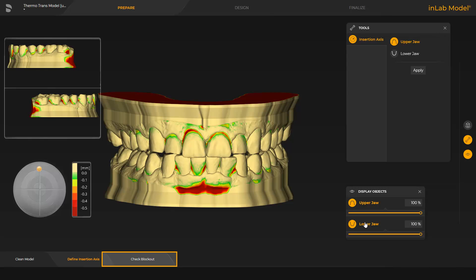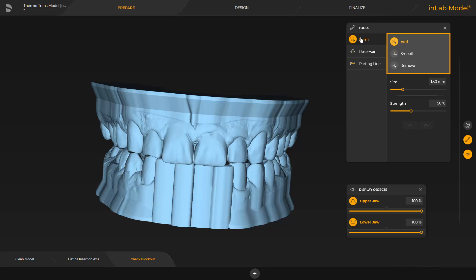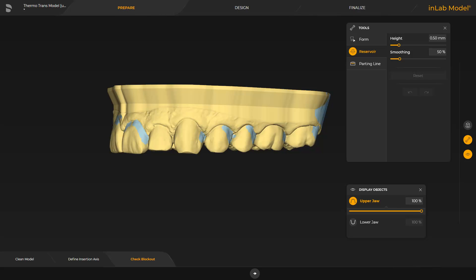Check Blockout. This step has three tools available. With the Form tool, you can add, smooth, or remove wax. We go to the next tool, Reservoir. This tool allows blocking out areas. To define this, we start with a double click, keep placing further single clicks, and finish the area with a double click.